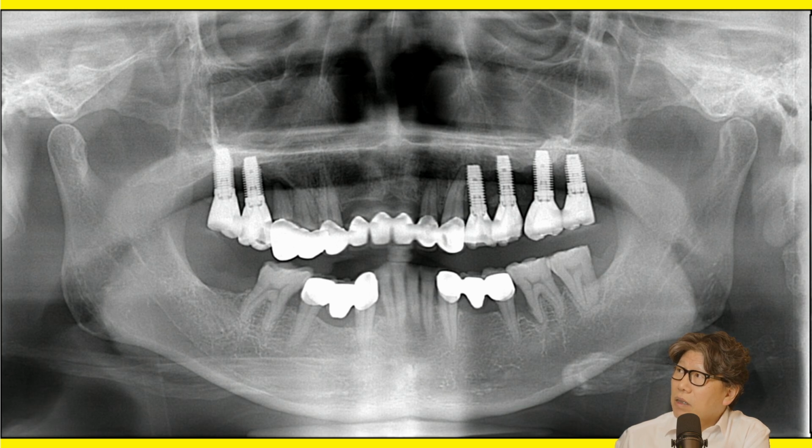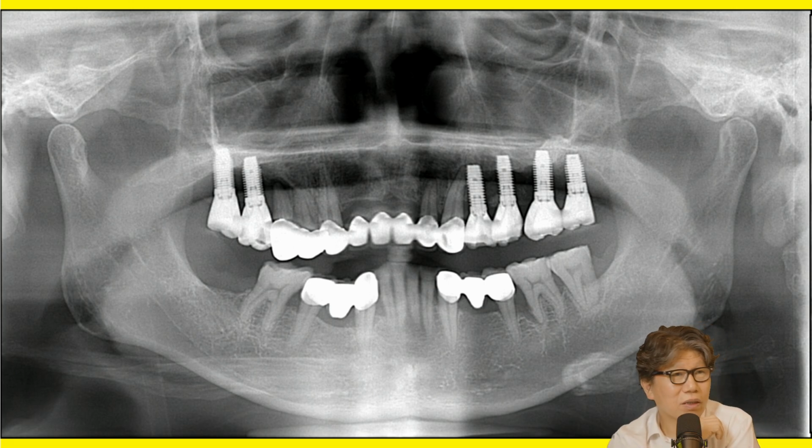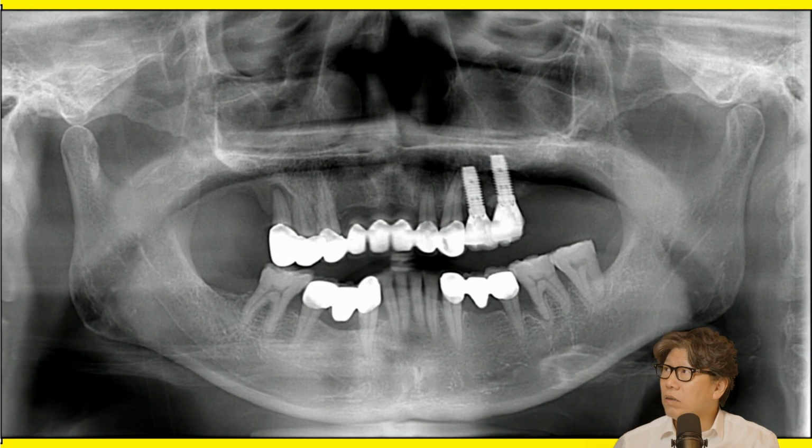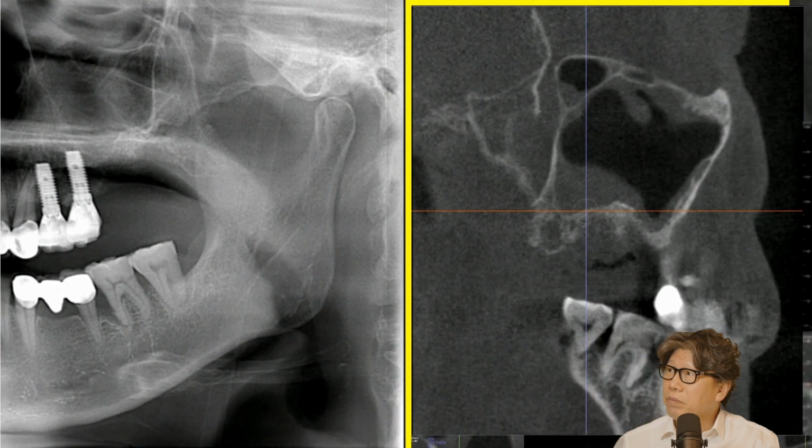And even if this is only attached to this end, this has no mobility. I think it's like that with Company O, and I think it's like that with almost all of the domestic implants. So what happens is, this is extensive horizontal bone loss. It's kind of a horrible situation, and I feel so bad for this patient. I tried so hard, and I'm sorry it turned out like this, but anyway, minus the extraction.